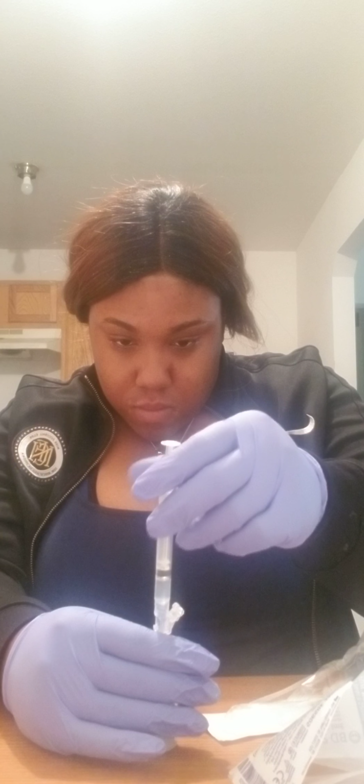So right now we're going to do ID, which is TB. Now I don't have all my things, so we're going to pretend this is a TB. Okay, before we do anything, we will go to our MAR and make sure we have everything we need.